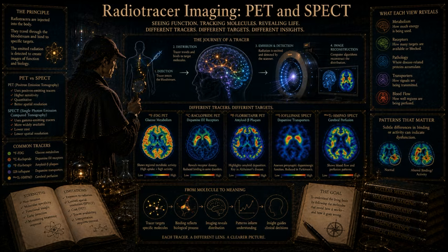First, we bring the subject into the imaging suite and perform a standard baseline PET scan with a D2 tracer, usually 11C raclopride. We calculate their baseline BPND. Let's say, for the sake of numbers, we find they have 100 available VIP parking spots. Okay, baseline established. Then, while they are still in the scanner, or shortly after, we administer a pharmacological dose of dextroamphetamine intravenously. Amphetamine enters the presynaptic dopamine terminals and wreaks havoc. It forces the dopamine transporter to run in reverse, and it breaks open the storage vesicles. It dumps massive, unphysiological amounts of stored endogenous dopamine directly into the synapse. A tidal wave of dopamine.